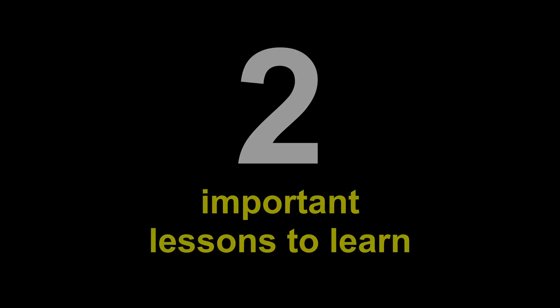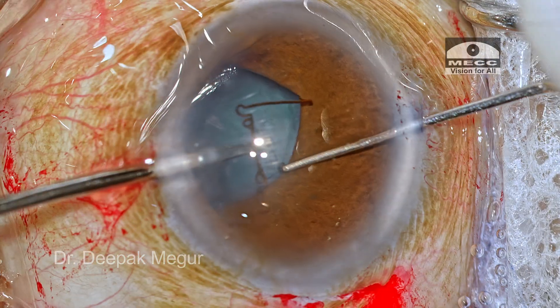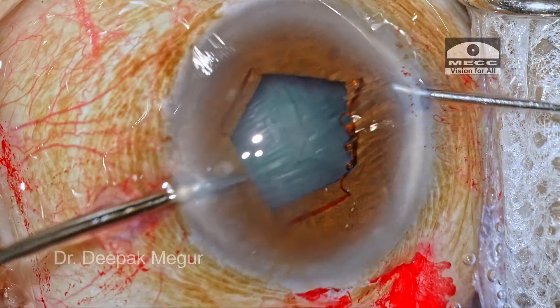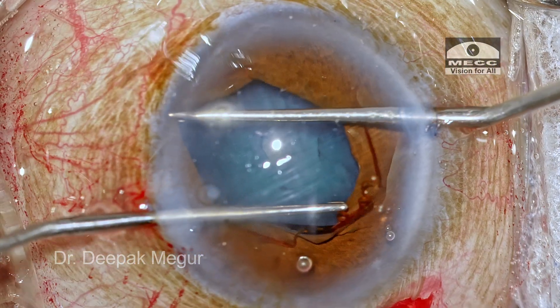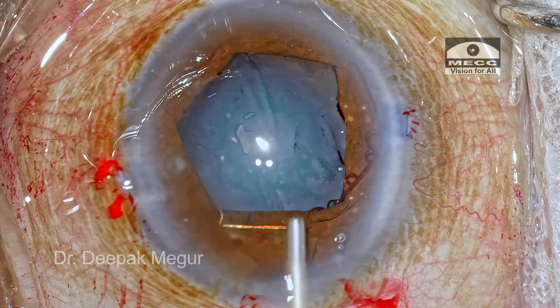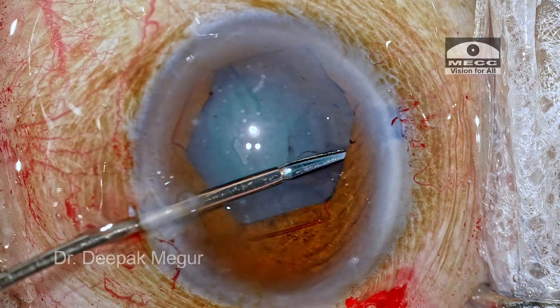To summarize, two important lessons from this video. First: when stuck with a rigid pupil, having not pre-stretched, and finding it difficult to engage the last two notches — the solution is simple. Put in OVD, go back and perform the stretch maneuver. Sphincter tears will ease the iris, the pupil becomes less rigid, and it becomes easier to engage the remaining notches. No need to panic.